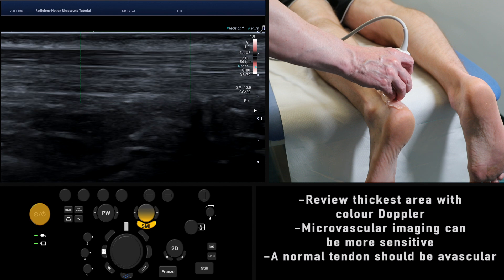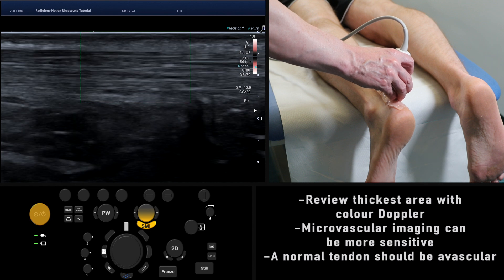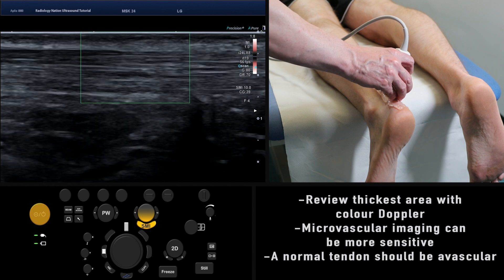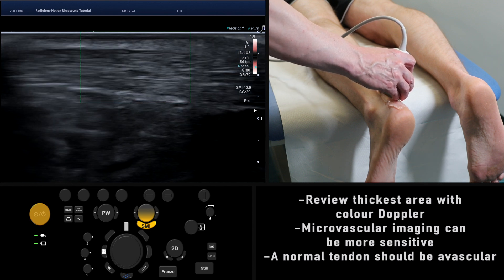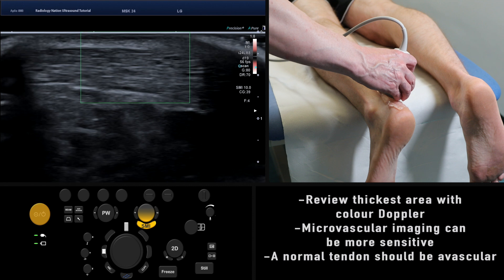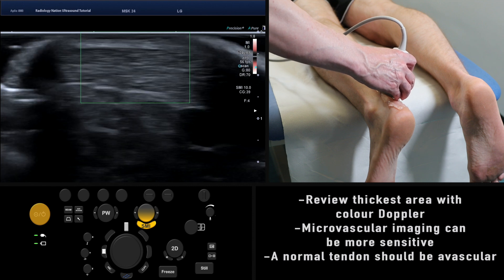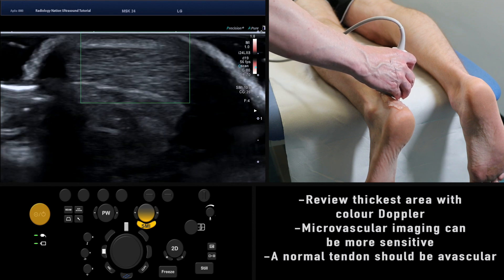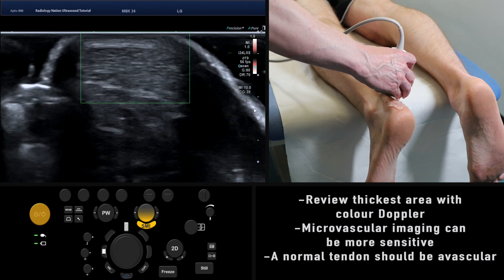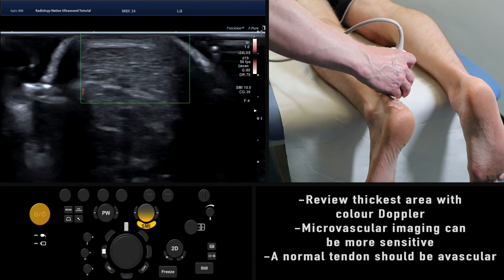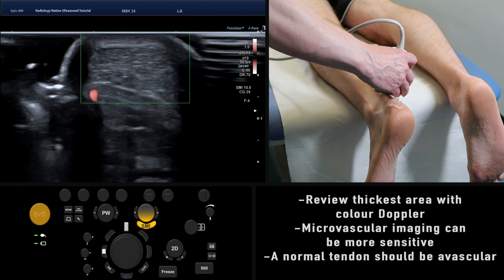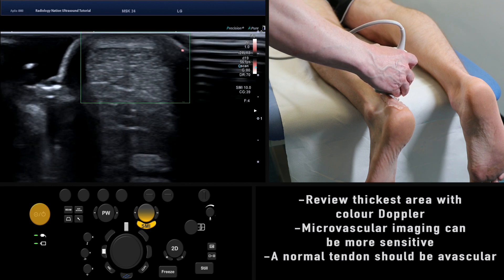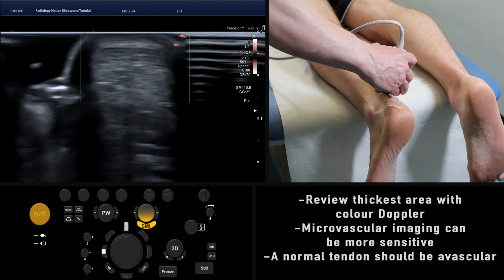Some more modern machines are equipped with microvascular imaging, such as the Canon SMI. Here we enable SMI to give a more sensitive assessment of the tendon. In this example, the tendon remains avascular and is therefore normal.